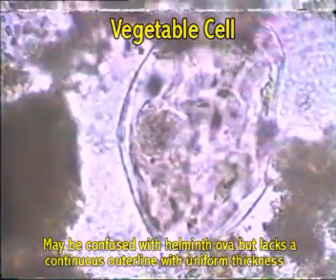Sometimes artifacts can be confused with parasites during examination of faeces. Let us now look at some of the artifacts commonly seen in faecal smears.